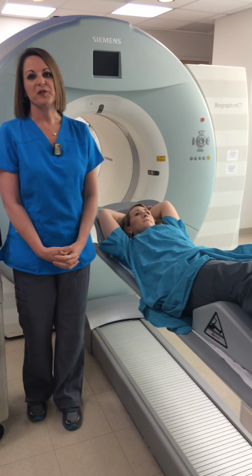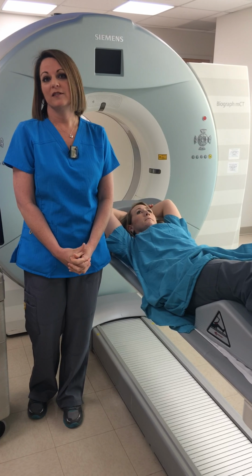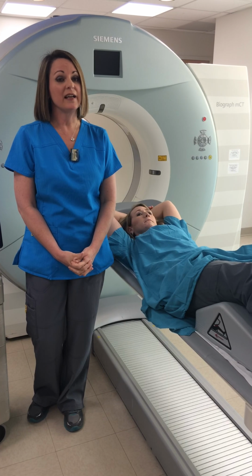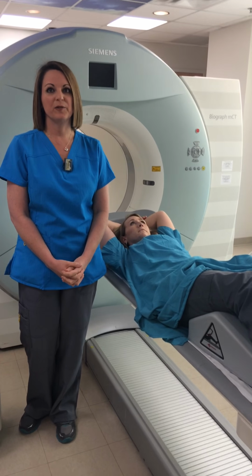Most people fall asleep during their pictures. There's very minimal breathing instructions. A lot of people don't have a problem at all. If you are claustrophobic, you should ask your doctor to prescribe an anti-anxiety medication that will help with any problems that you have laying inside the scanner.